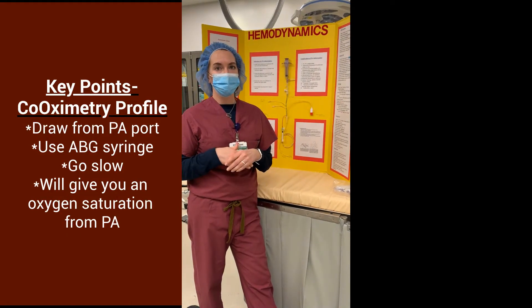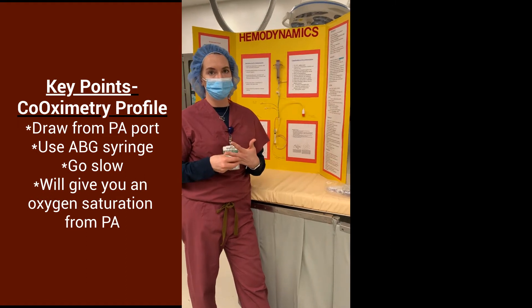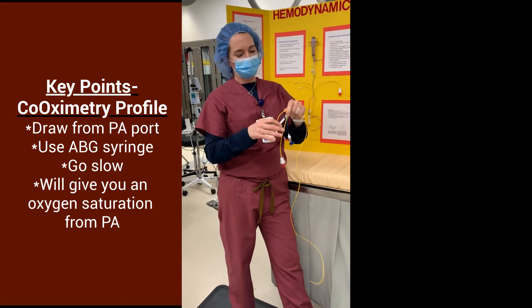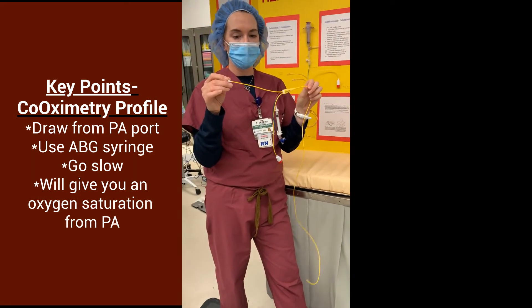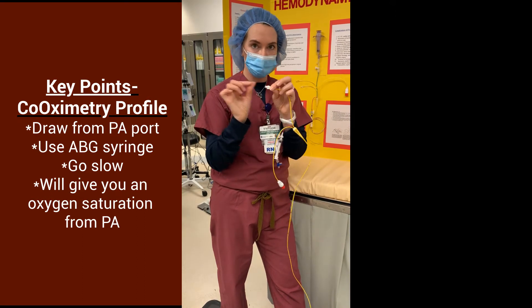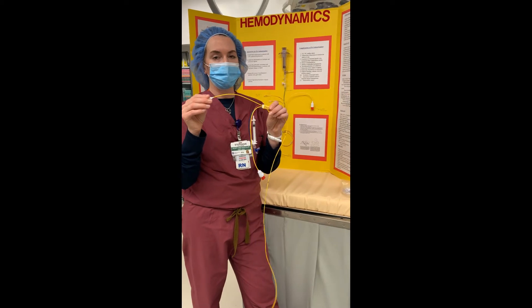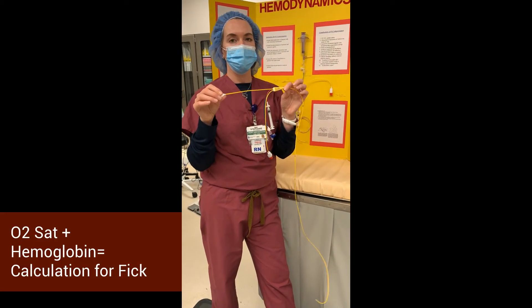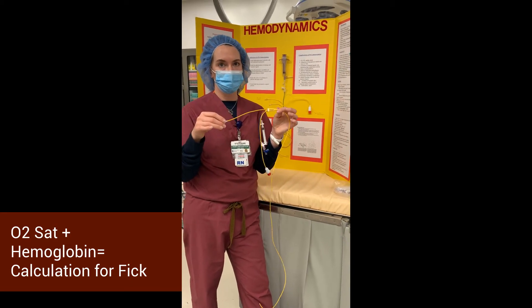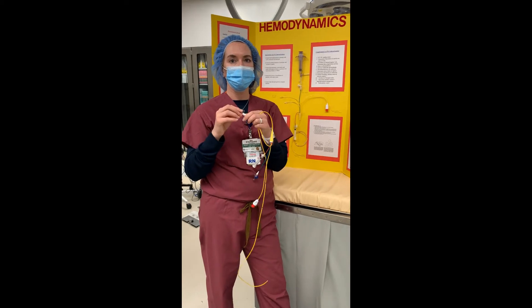When you draw a Fick you're going to want to take what's called a co-oximetry profile — you've probably done one before. You'll draw that from your distal PA port on the catheter using an ABG syringe. If this is hooked up to tubing you'll have a stopcock; discard blood first, then use your ABG syringe to slowly withdraw blood from your PA port to get an oxygen saturation from the pulmonary artery. It will also give you a hemoglobin — you'll use those two numbers to calculate the Fick in the Epic flowsheet.